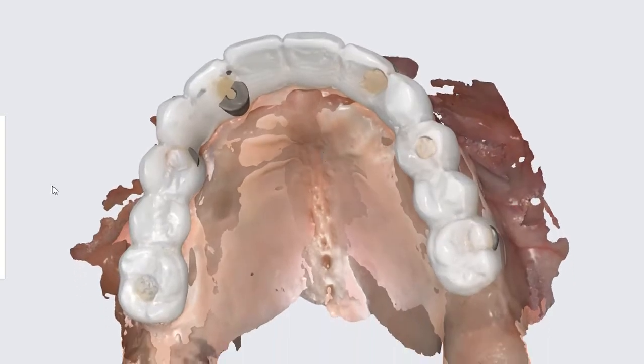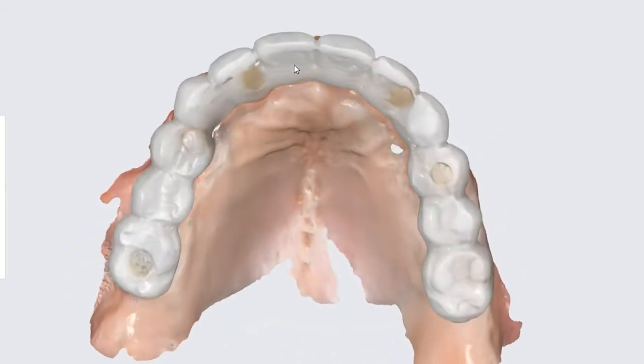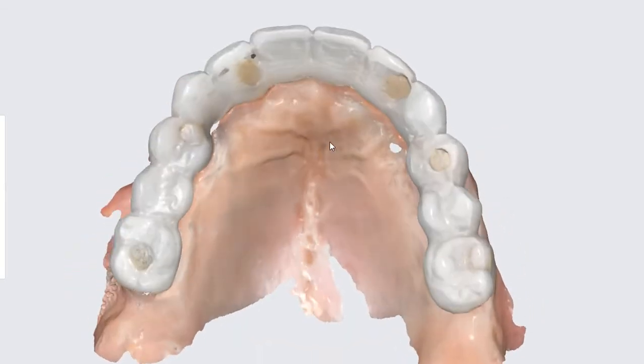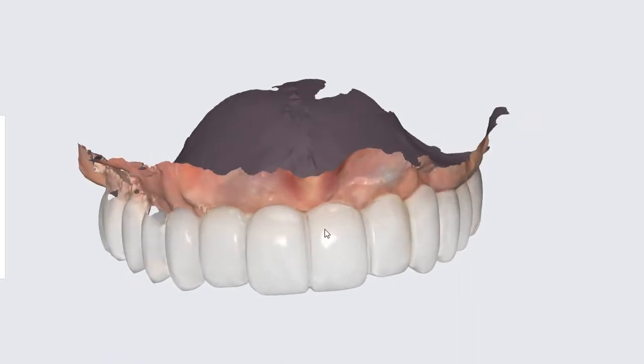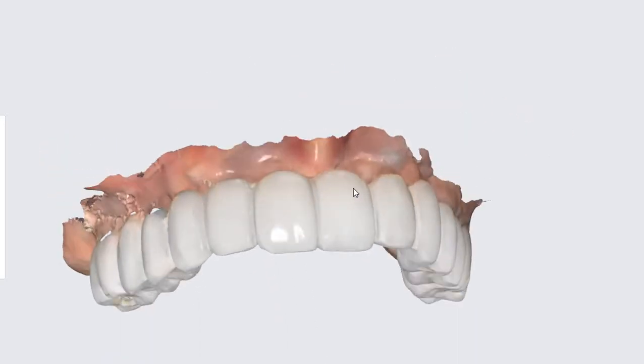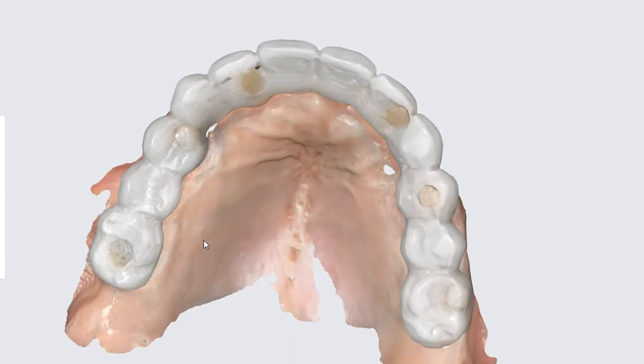This is her preoperative scan with all the aesthetic changes to the incisal edge, the CEJ, whatever else I need or don't like. Then I will remove the provisionals and scan the soft tissue of the palate with the provisionals out.